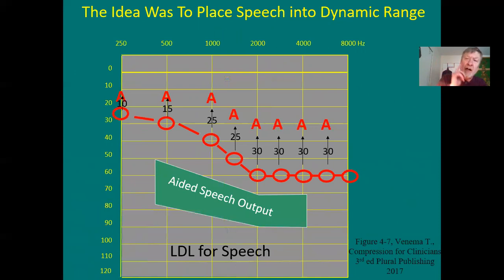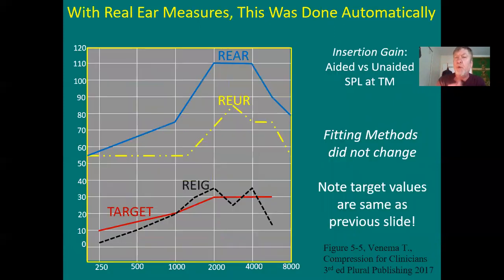And real ear allows you to see that. Yesterday's real ear didn't, though. Today's real ear does. So in a weird way, yesterday's real ear is like a hiccup. It's a weird thing, but you got to cover it so we know what it was. Here's yesterday's real ear. So let's look at this very carefully. Read what it says here.